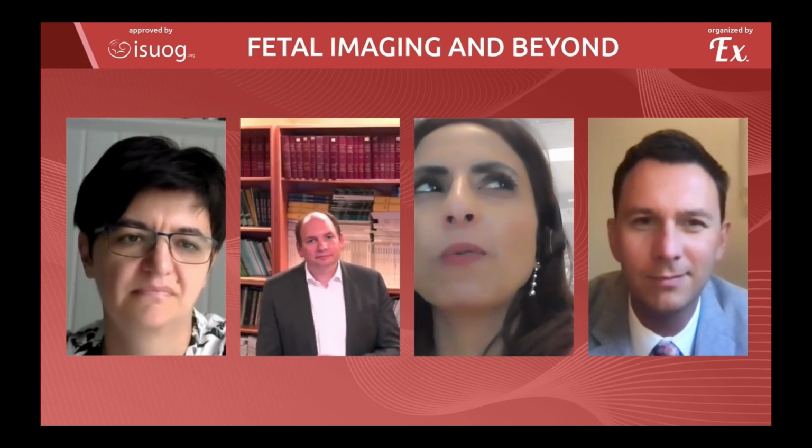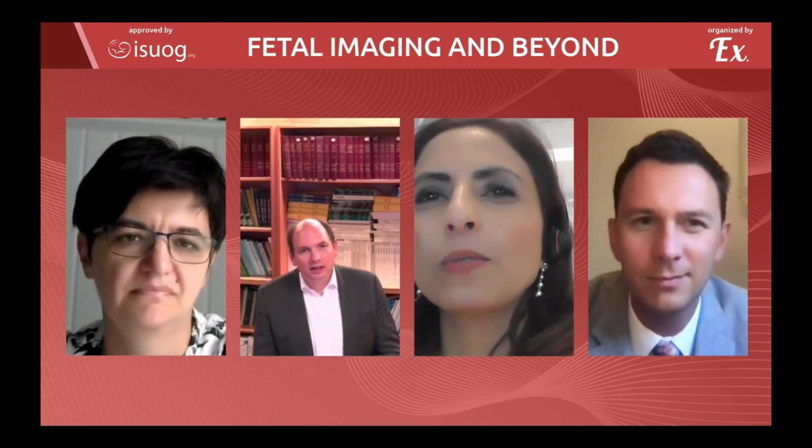It's a really interesting comment, because I didn't know that. I didn't know that the sensitivity of the MRI goes down late in pregnancy. I didn't realize that. So I certainly learned something new today. So thank you, Gregor. Why do you think so? What would be the explanation?